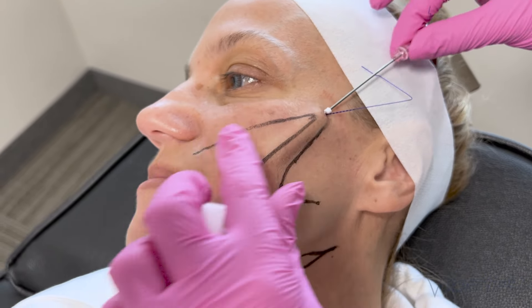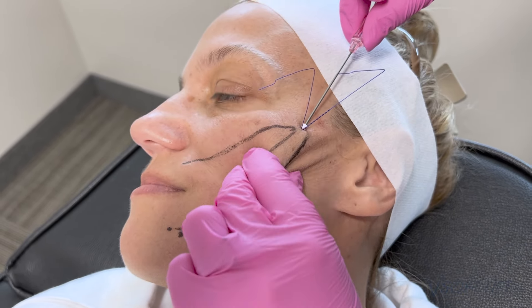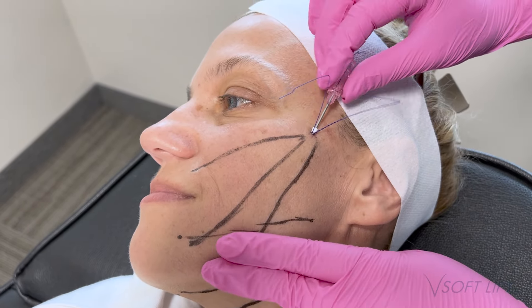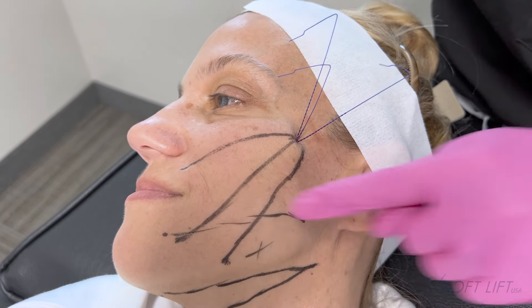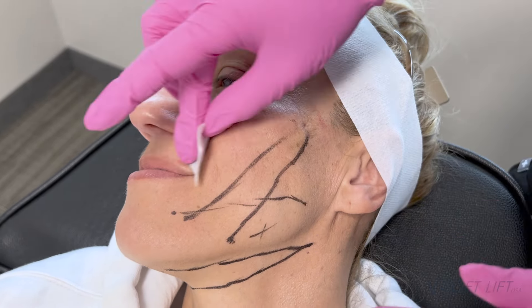For this patient I decided to go all the way past the area of animation. This is really important, especially in the nasolabial fold and marionette areas — due to smiling and facial expressions, we don't want the thread to be visible. I either go all the way past or stop slightly in front. Now going in with our marionette thread — I shimmy down the vector, tent up, and make sure I'm at a very even depth. Uneven depth can cause puckering that patients notice. Going in with our last vector, for the jowl — I have my facial artery marked off to avoid unnecessary bruising.